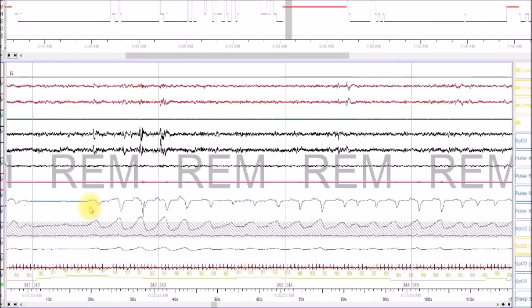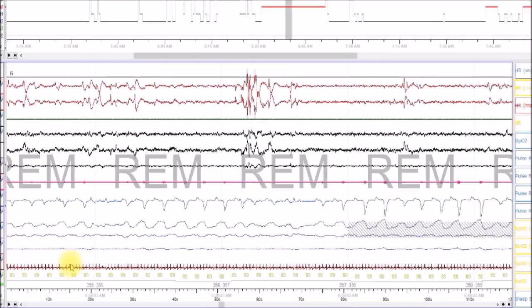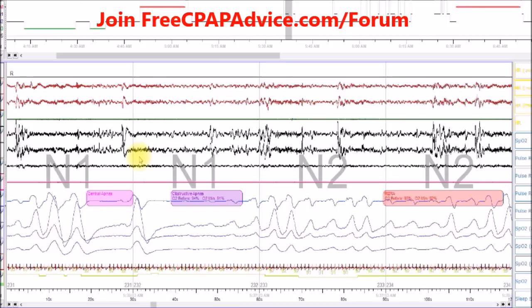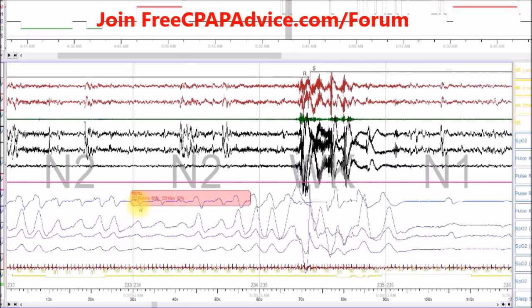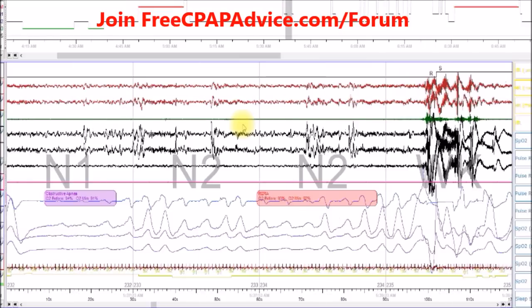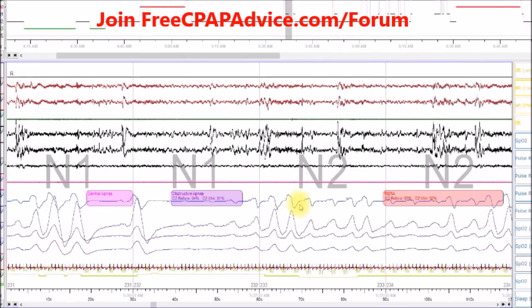Unfortunately, there are some other things going on that makes this complex. Here's one example that really illustrates complex sleep apnea. So here you have a central apnea, then you can see an awakening, then right back to sleep. But this time you can see that the belts are moving — so that was now an obstructive sleep apnea with an arousal. And then this leads into a respiratory effort related arousal, where there's a clear decrease in effort and a decrease in breathing leading to another arousal. So you have three different types of events here, all in this two-minute segment.